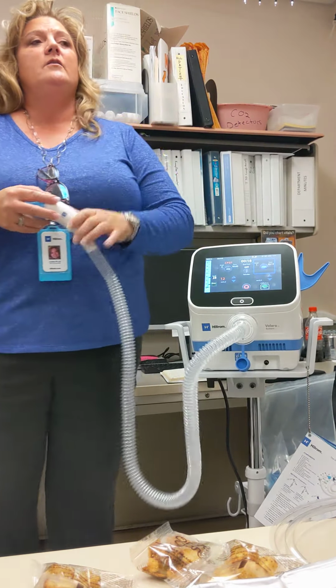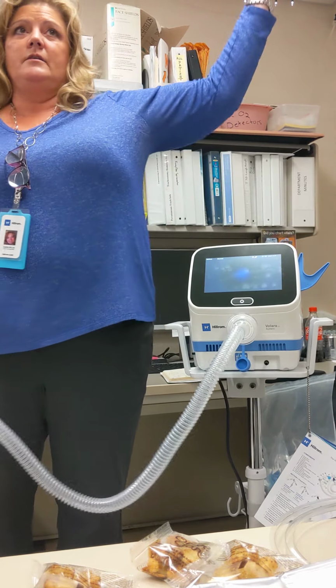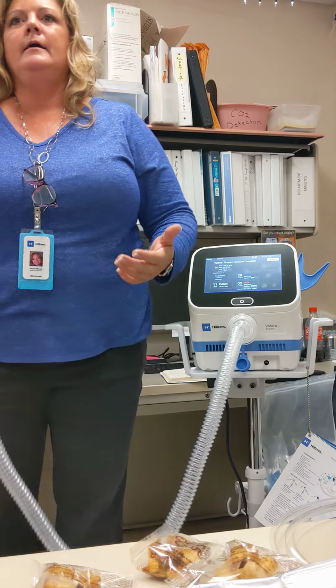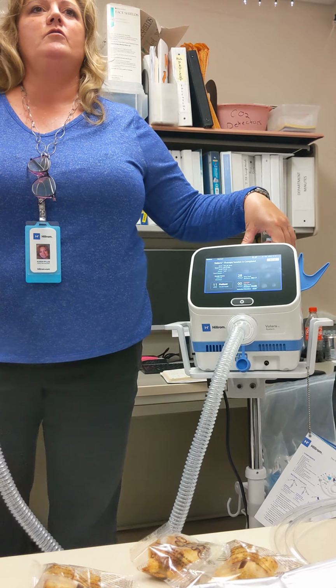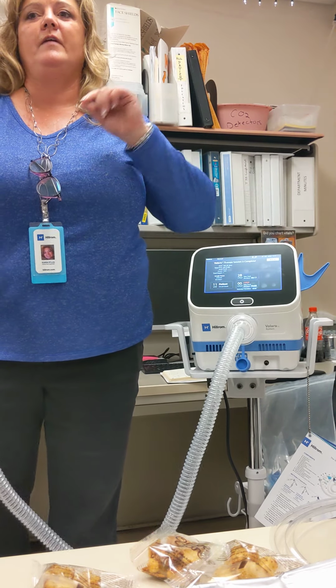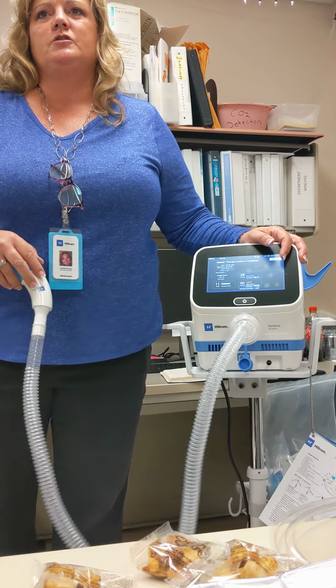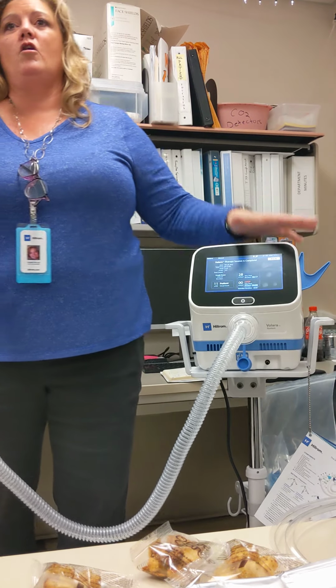Now, you might also see that the patient might be desatting, like let's say they're at 92 and then they drop to 82. Why? It could also be the function if you have volume on and not pressure on your vent. You maybe want to change it because this is pressure, not volume.